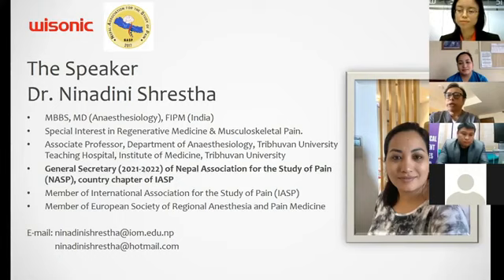But with the development of medical science, especially technology, nowadays in pain clinics most pain physicians are using ultrasound for better diagnosis and treatment. Today we'll try to share a small light on this vast topic regarding ultrasound imaging and intervention.